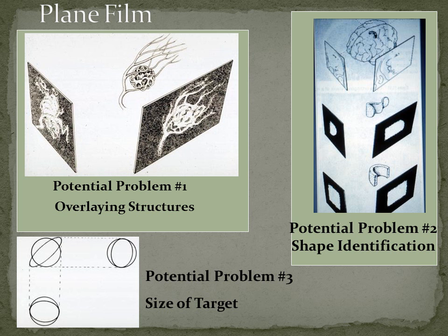Now, why do we stop using angiography? Well, 2 reasons. One is we could, because we got a better database, which was CT scanning and MR scanning. The other one was that angiography does not give you the true shape of a lesion. And so if you look at these examples, these are just some easy ones to draw. You've got a nidus, and what you need to do in order to do a true 3-dimensional mapping is you need to be able to tell where this spot is in this image and this image.